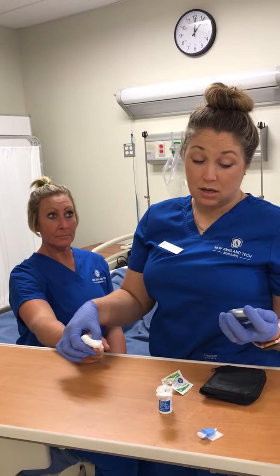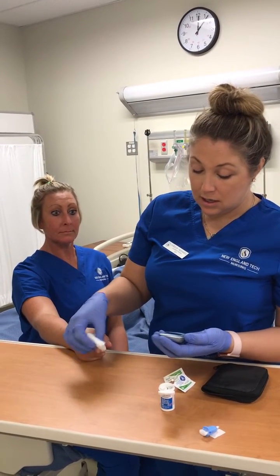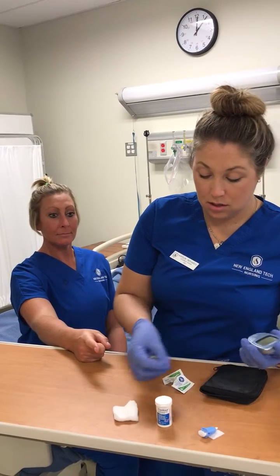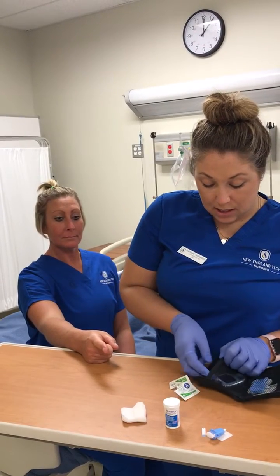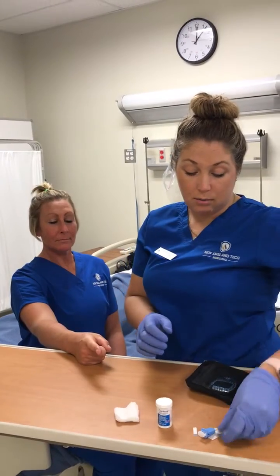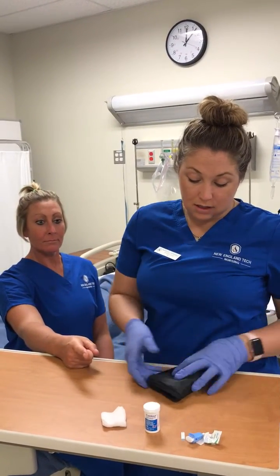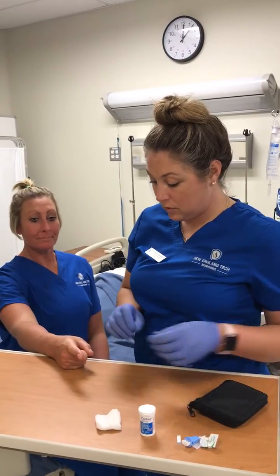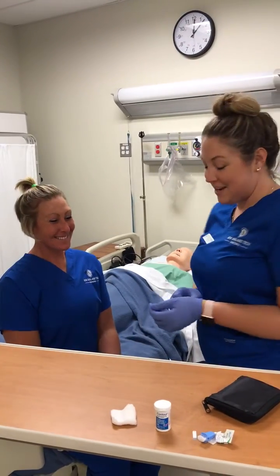A normal reading would be between 70 and 130. Anything over 130, you would administer the proper insulin. Anything under, you would administer some sugar. I would document my findings, and if anything was abnormal, I would also report that as well. I would then apply a bandage to the patient's finger.